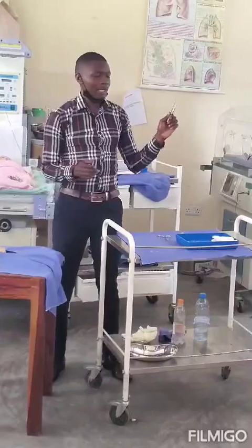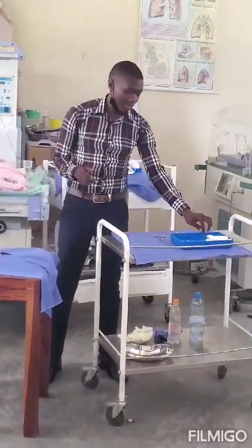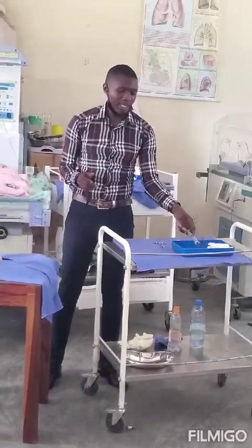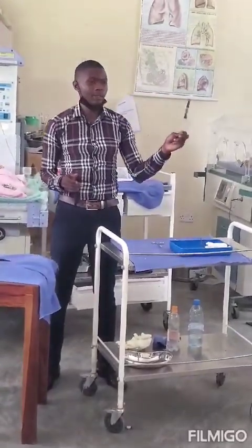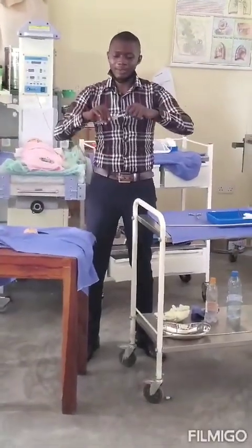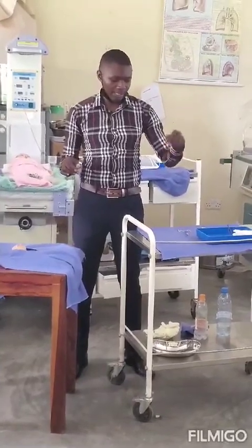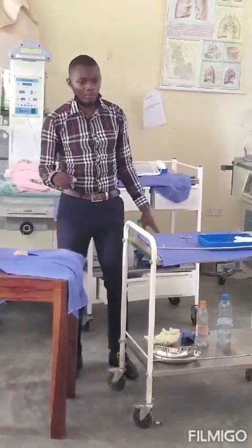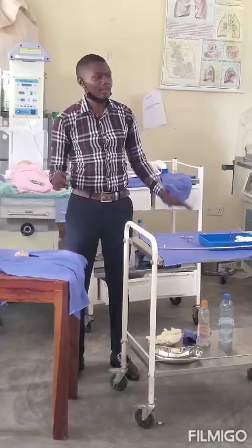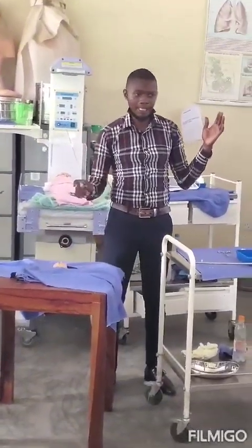So at this point now, you are ready to give the lignocaine. You are going to drop the dissecting forceps like that, and then pick the lignocaine. Hold the needle this side, the way I'm holding it, then pass it on to this hand, and this hand removes, you discard. This hand, don't drop it, leave it like this, because immediately you drop it, you have contaminated. And you are going to inject the lignocaine with one hand.